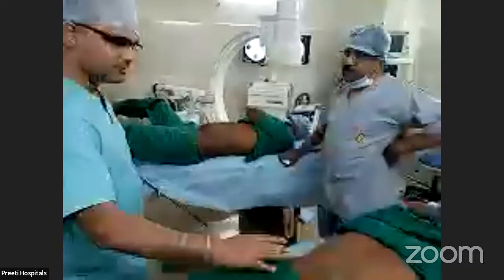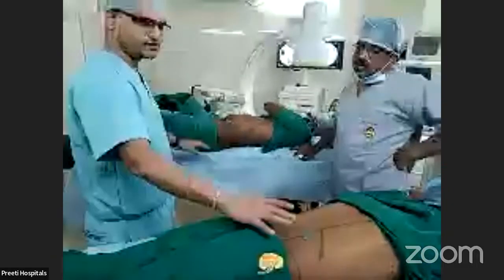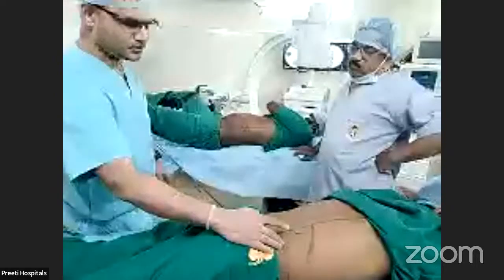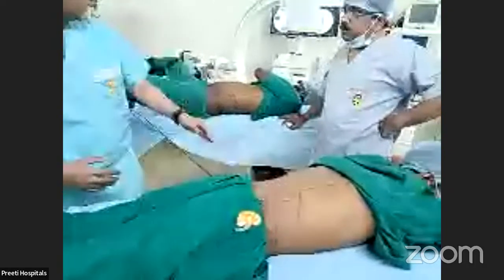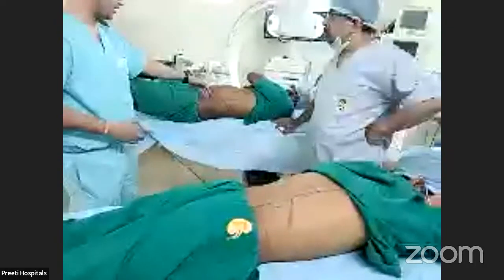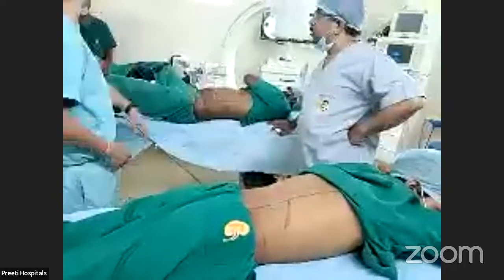So for a pelvic stone, there is not much difference between prone and supine PCNL. We can access different anatomy. In prone PCNL, we can come from either the inferior or middle calyx depending on the RGP, and the same can be done from either the inferior or middle calyx in supine also. So there is not much difference.